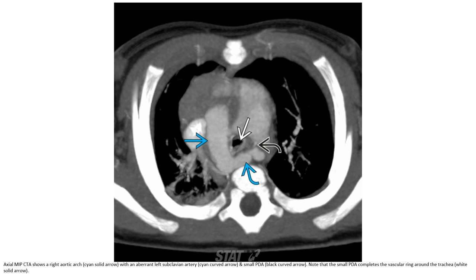On cardiac CTA on the right, we see an aberrant left subclavian artery and a small PDA. Note that the small PDA completes the vascular ring around the trachea.